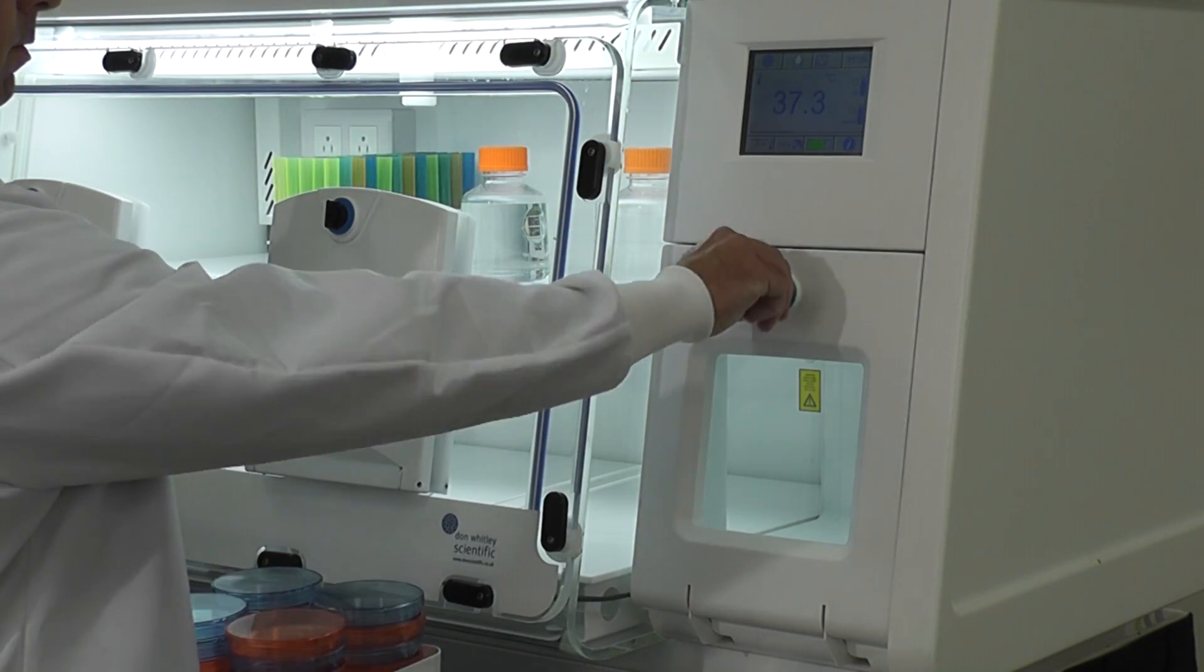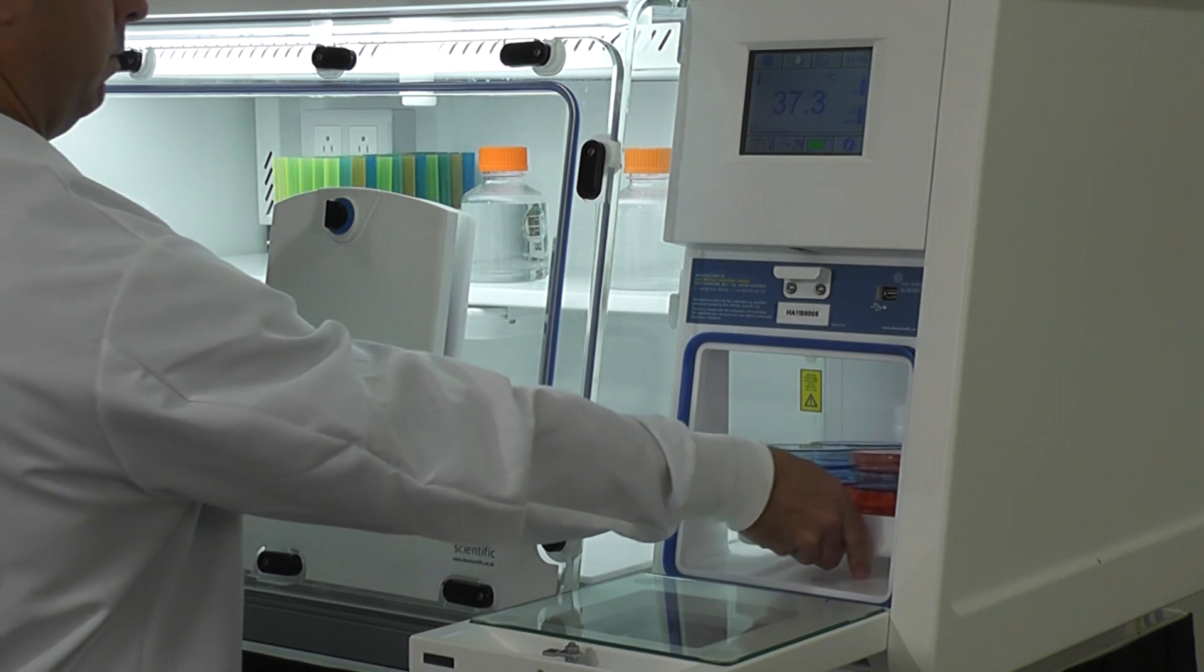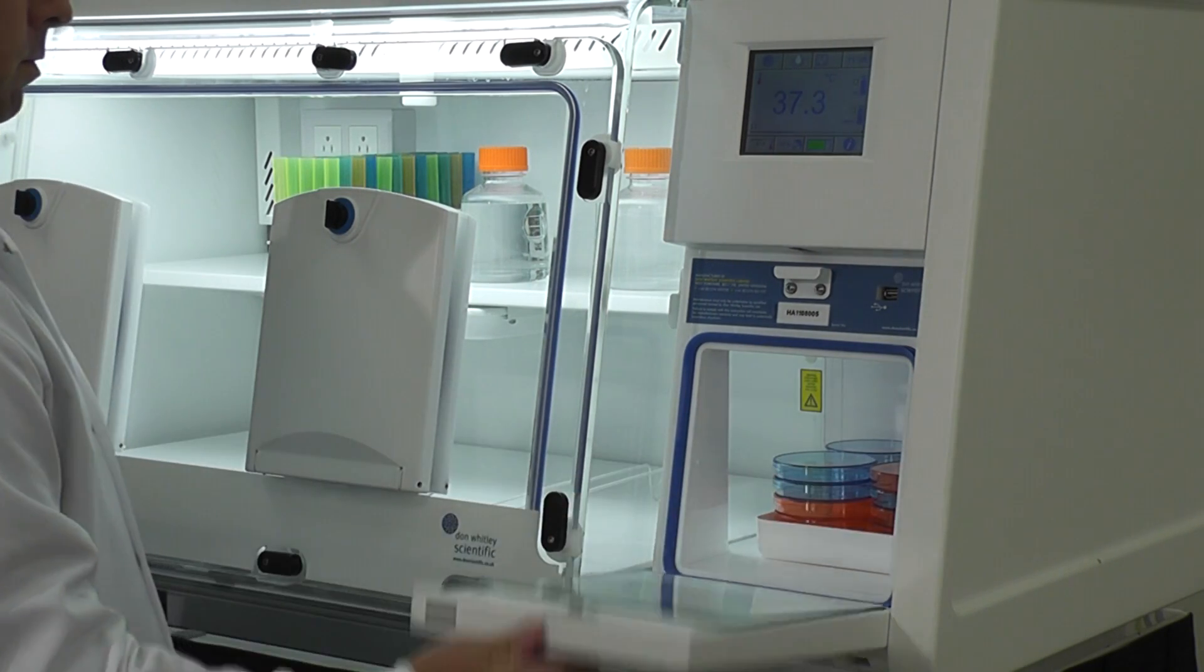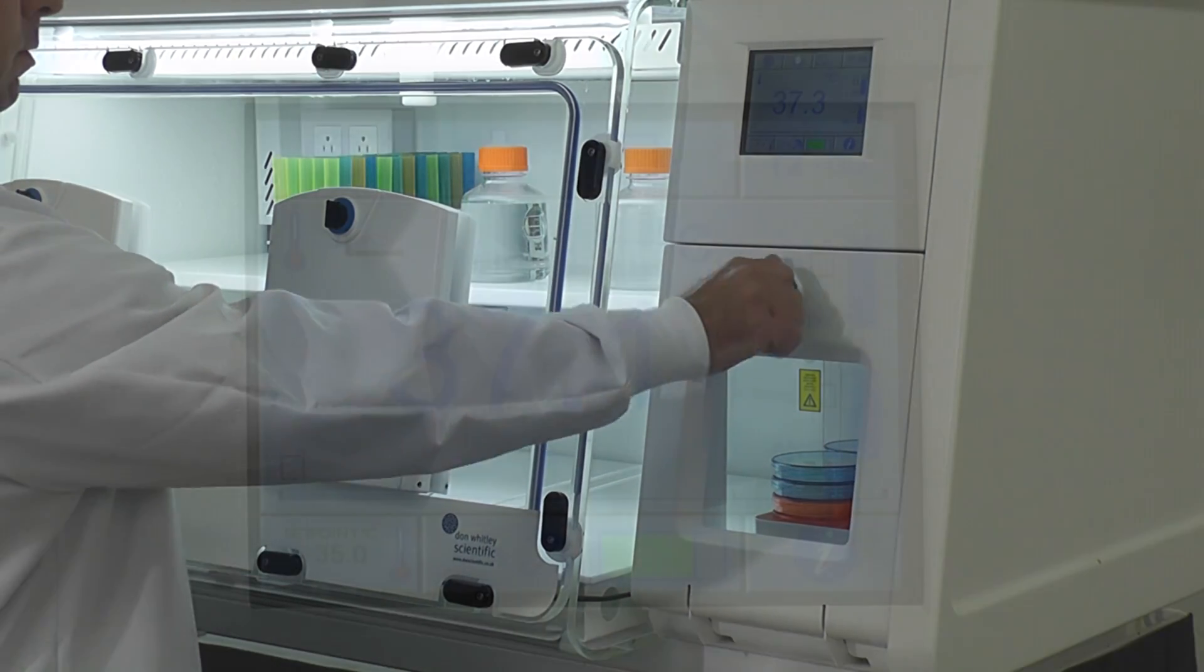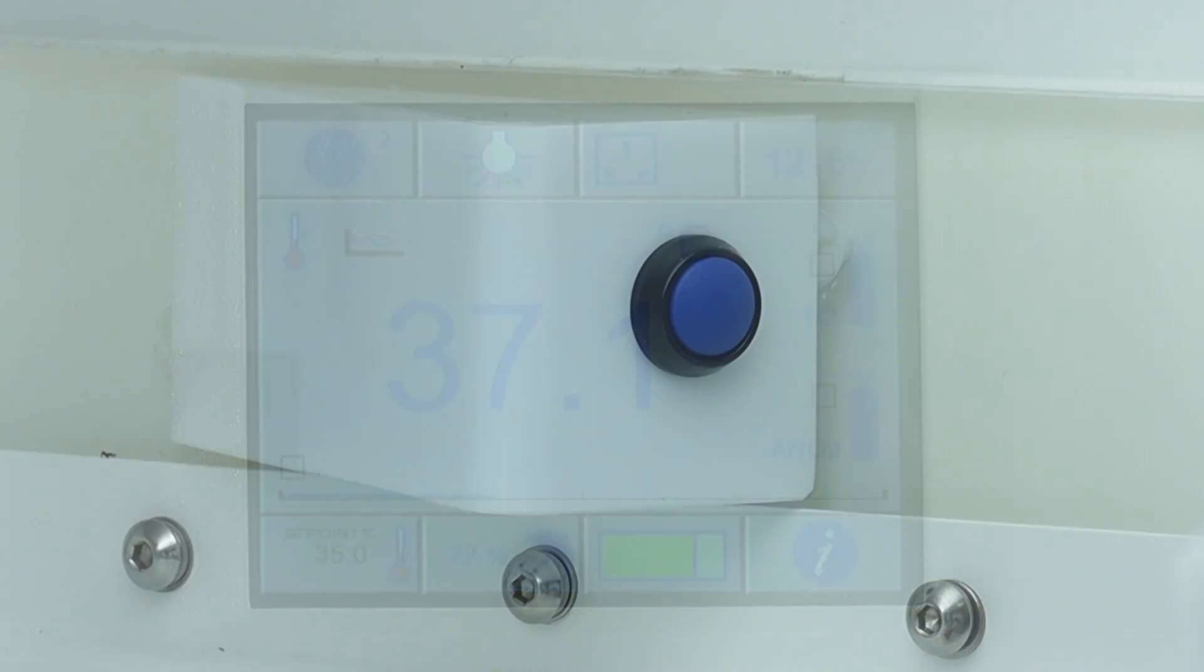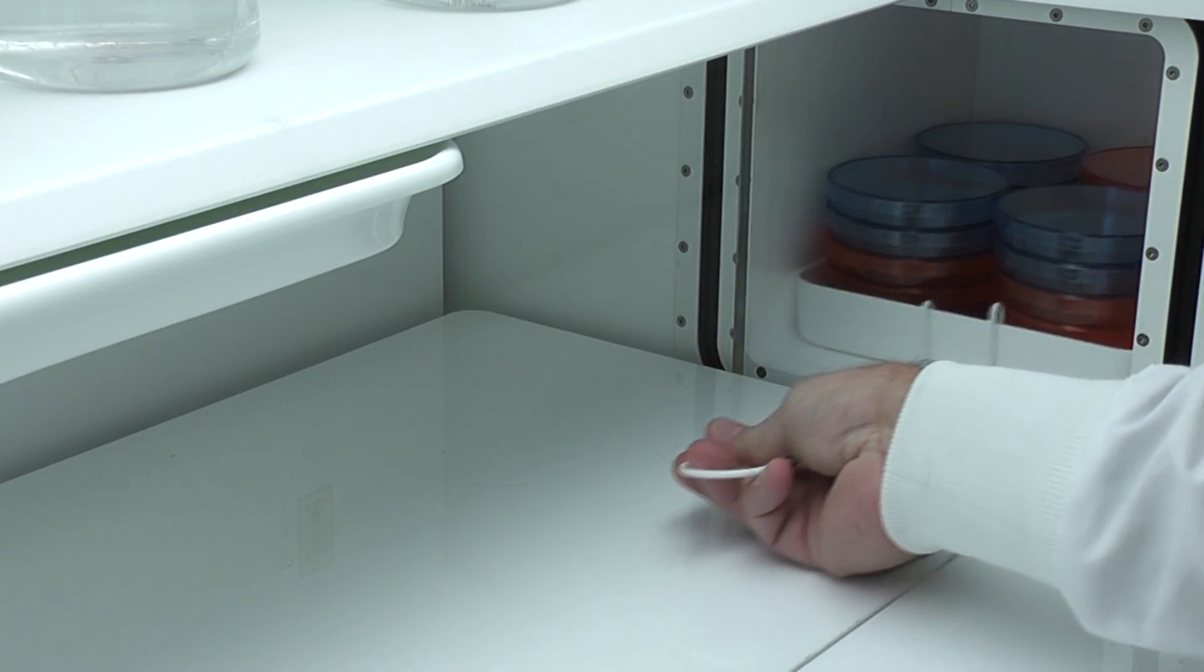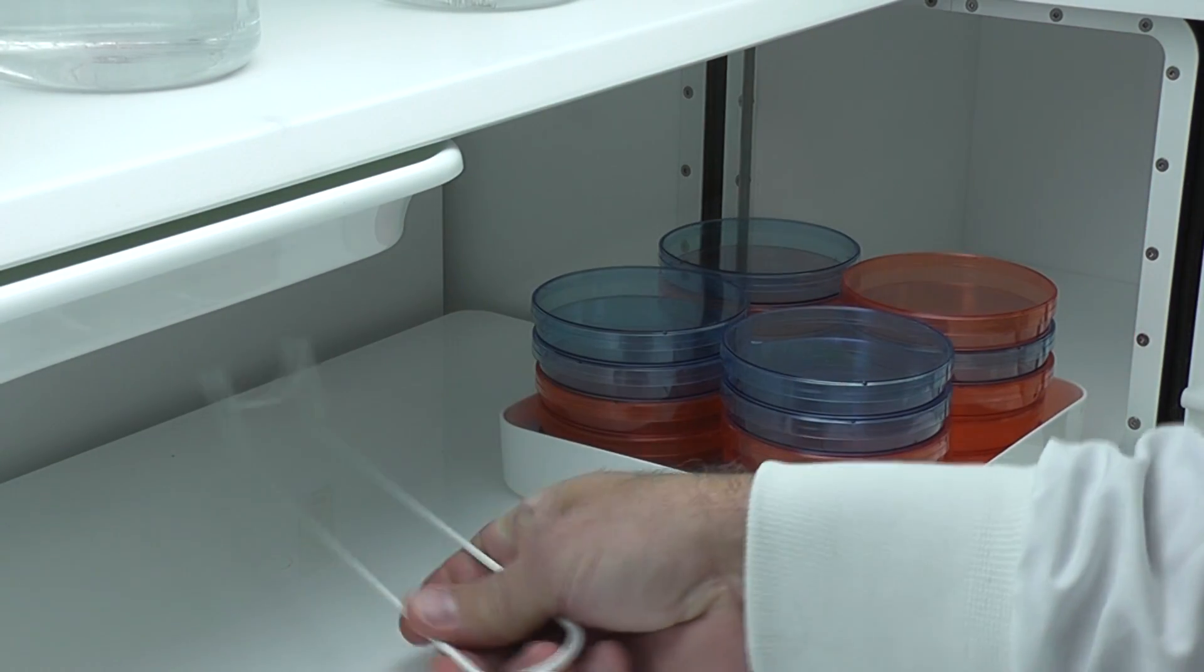Operating the airlock is very simple. Open the outer door and introduce your samples using the tray, then close the door. Initiate the airlock flush sequence by depressing the icon on the touch screen. After 60 seconds, the sequence is complete. Depress the blue button from within the workstation to open the inner door. Using the hook, pull the tray from the airlock into the workstation.